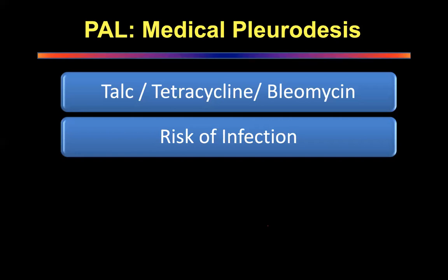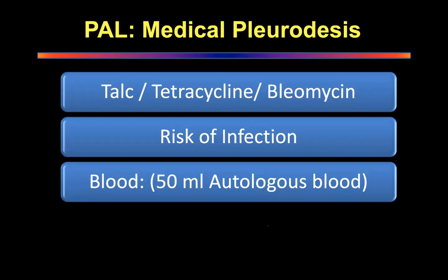You must remember that when you're pushing something into a post-operative chest, there is always a risk of infection. So whenever we do these procedures, we do them almost with surgical precision and surgical disinfection. We make sure that everything you use, you do like a proper surgical procedure. Even if you're doing it in a side room of a ward, just make sure that you do not introduce infection into the chest. That would be a disaster. Some people have used blood. It was quite popular earlier.